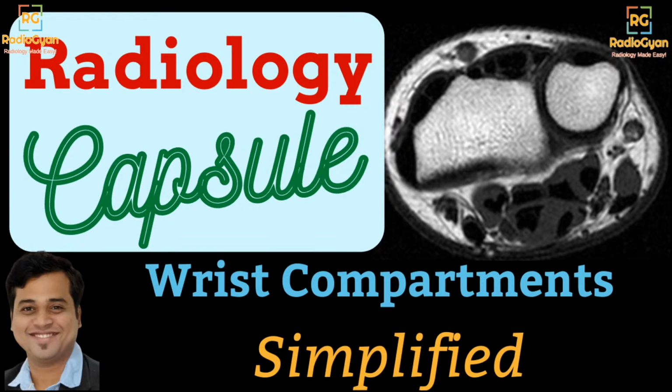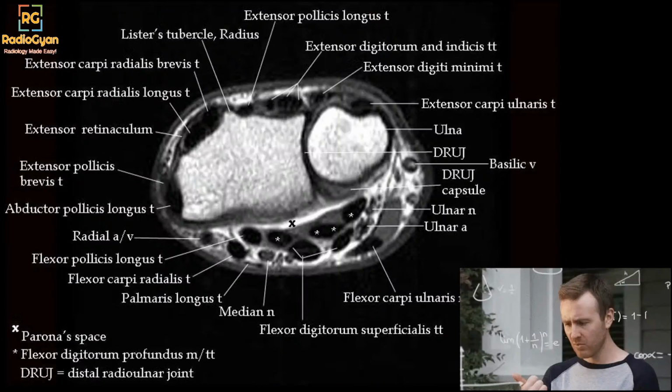So what we're going to do is discuss the anatomy of the wrist and try to simplify the wrist compartments and the related pathologies. This is a complex topic, so we'll go slowly so that all of you understand. We'll not go in depth because we first need to understand the anatomy. Once we are clear with the anatomy, pathology is very easy, as in most MSK.